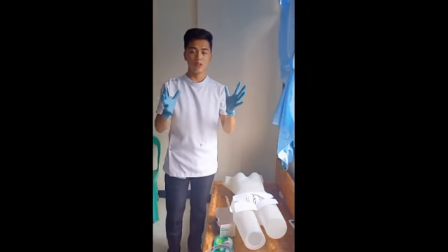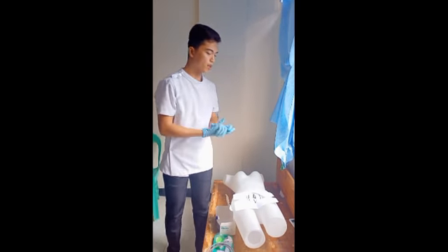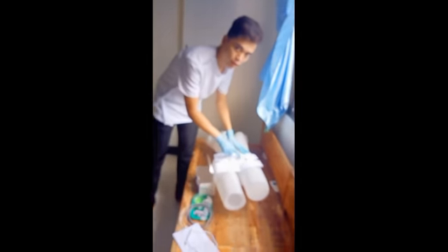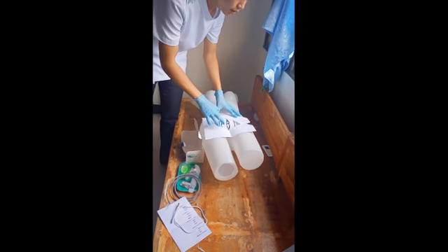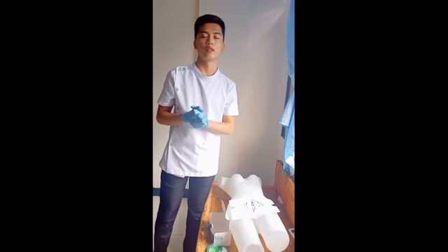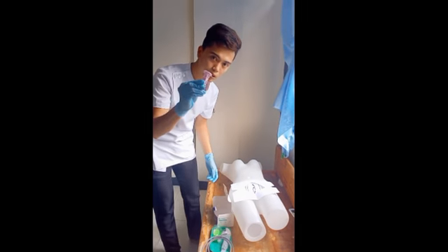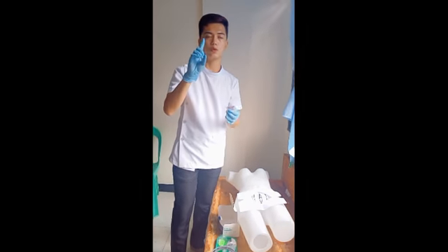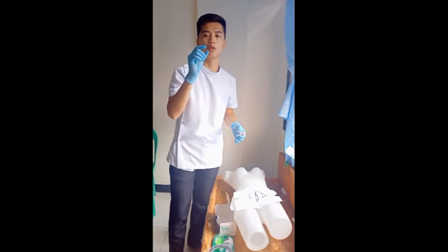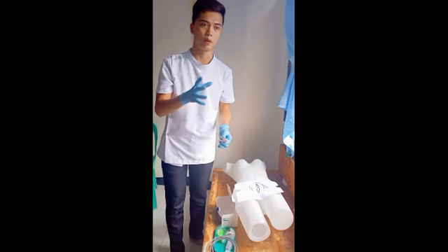So first, I'm going to clean the urethra. You need to clean this before you put in the urinary catheter. You should never use your hand to clean the urethral area of the patient.